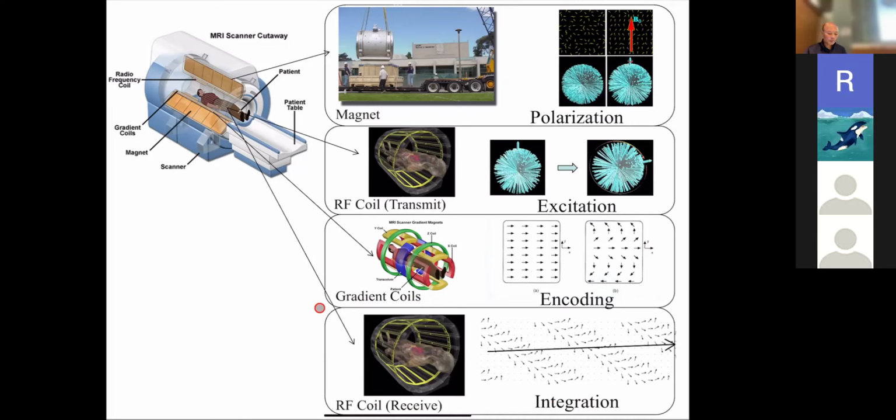Okay. But you can sort of see, as compared to CT, where there's sort of just one thing you need to know, which is basically the projection slice theorem, MRI, we have to sort of build it up until you understand these parts.